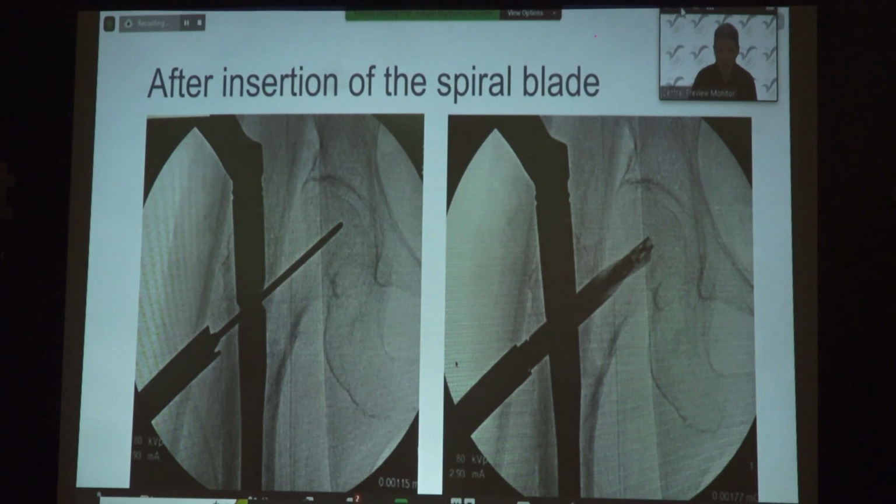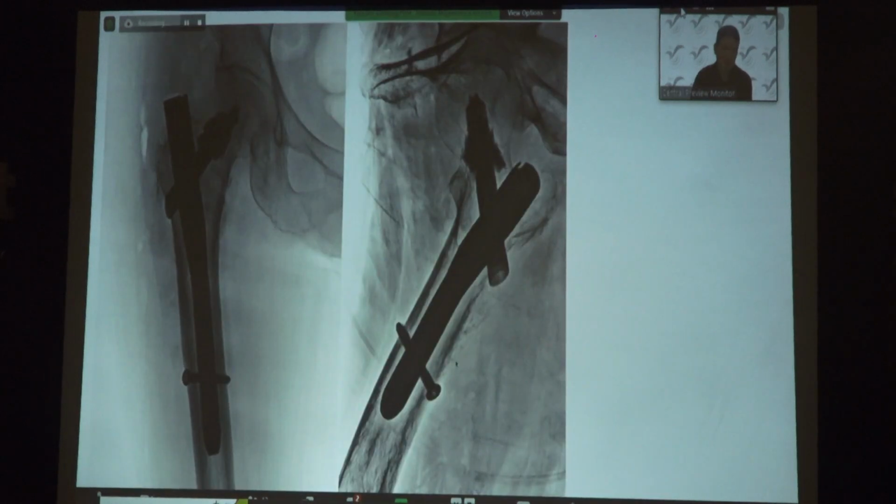After placing my blades, I found that it was way too off from the ideal position. I was puzzled, how should I solve this? Option one was to take out the blades and put in 5mm longer ones. Instead, I decided to cement augment this case.